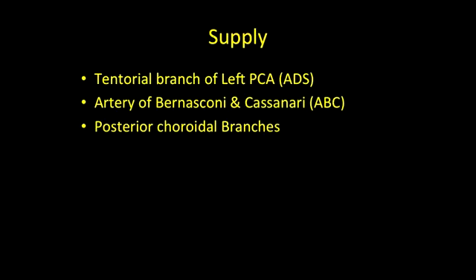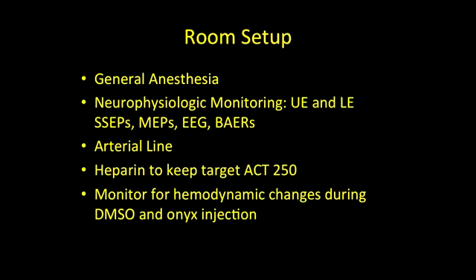Again, the fistula pocket was near the vein of Galen, and subsequent drainage was into an enlarged vein of Galen, which then drained into the straight sinus and the right transverse sigmoid system, with some reflux into the cortical vein, as mentioned before. Based on these angiographic features, we recommended treatment because the patient was having features of venous hypertension, with headache and imbalance.